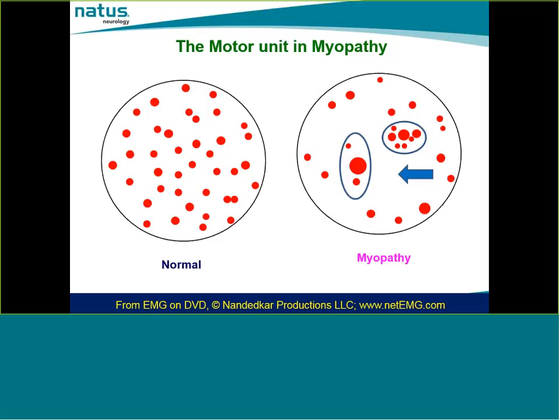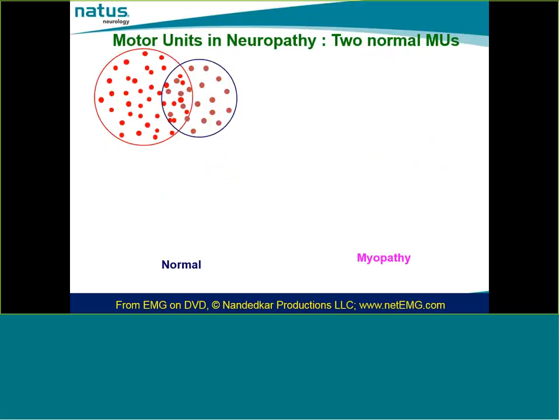And that's exactly the concept in motor unit potential analysis. With a normal motor unit, we have one kind of waveform for the motor unit potential, one kind of sound. And in myopathy, that sound and waveform is going to change because of this reorganization, or remodeling, of this orchestra.